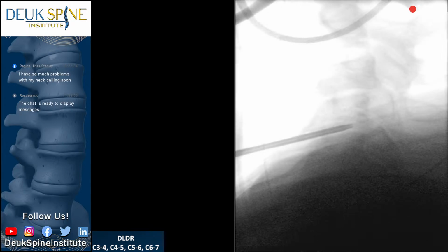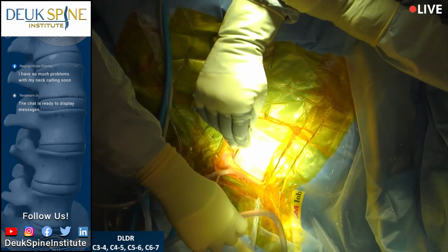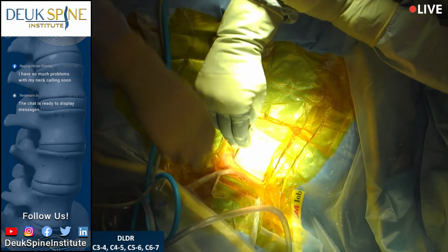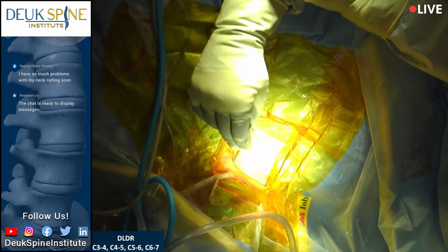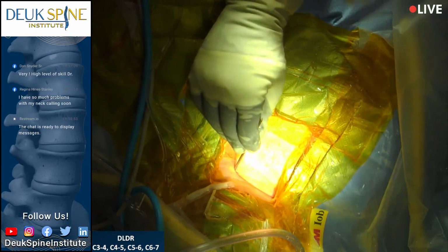It can't be bent that bad. Right? Watch that. All right. So, let's see where we are. A little bit overexposed. Let's see where we are. All right. So you can see the challenge here. I've got to take this dilator out and head down south. So what we're going to need is a little shoulder pull.